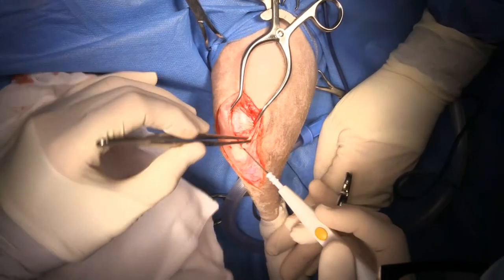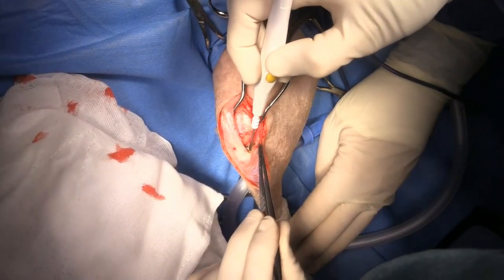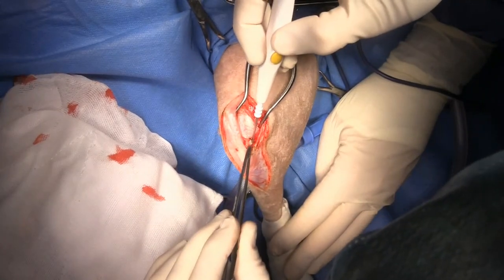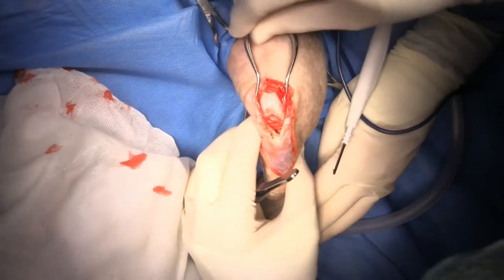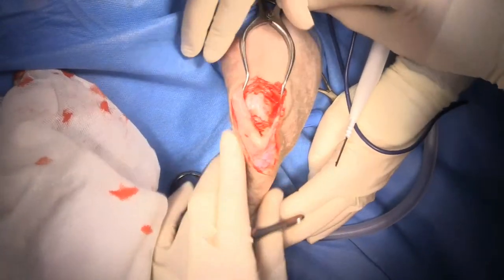You can already see our lateral condyle. I'm just extending my incision, and now we'll luxate the patella and then get the assistant to hold it up.